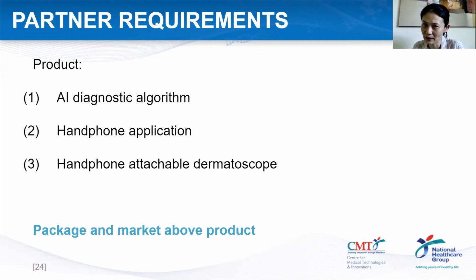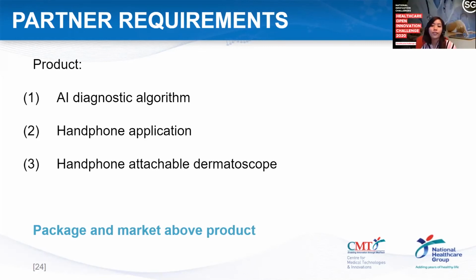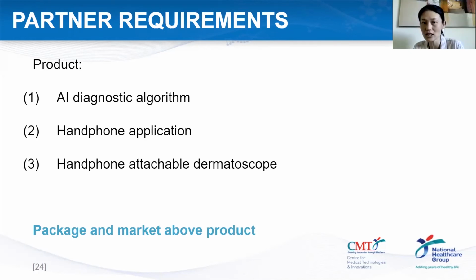I don't know if that's what they mean, whether they have to apply for a medical device certification? I think you're trying to understand whether there are other regulatory considerations to take into place. Doesn't really, because this is exactly like a dermatoscope now, and dermatoscopes are just bought over the counter. You can easily order one online and get it. So I don't think there's a specific regulation for the dermatoscope per se. Understand.